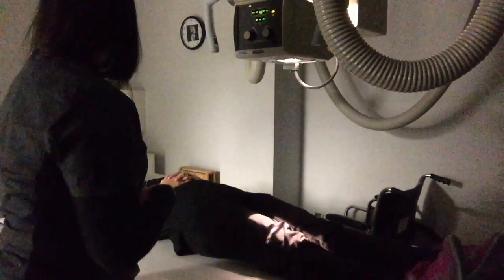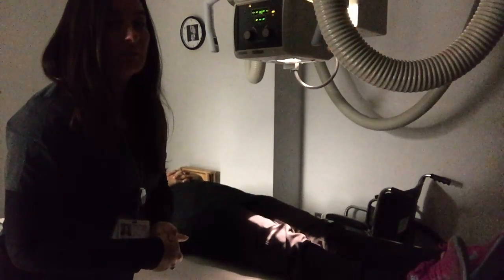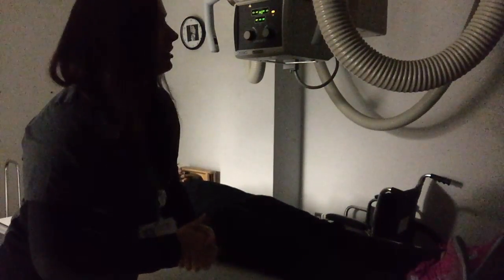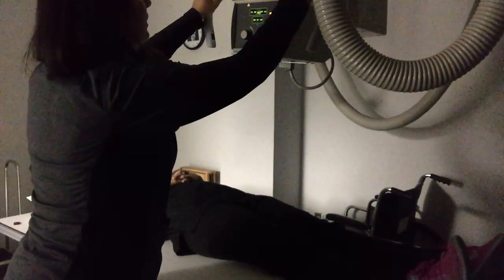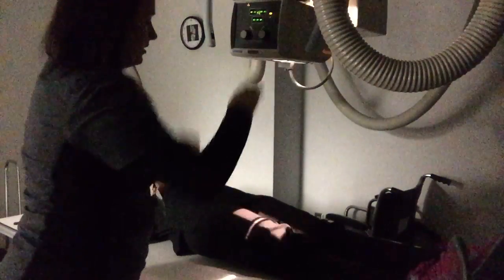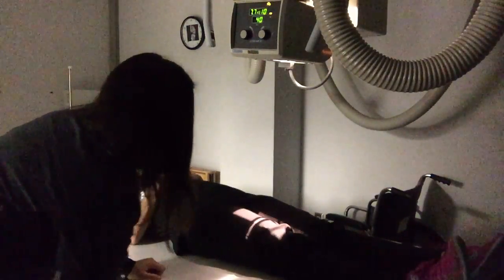So I already measured Mrs. Skaggs off camera, and we know that she is an average size patient. But for your practical and likely in your actual clinical site, you're going to see everybody angling up 5 degrees for every patient. So that is what we are going to have you guys doing for your practical, and that's what you'll be doing in your clinical site. So I'm going to go ahead and angle here 5 degrees cephalad. And since I did that, I have to move my bucky. So I'm going to move my bucky up and get aligned.